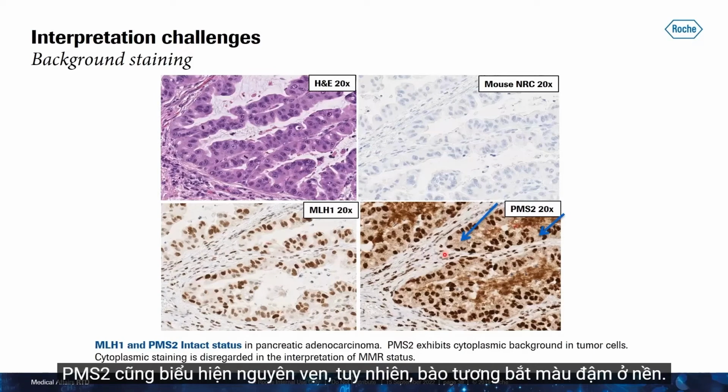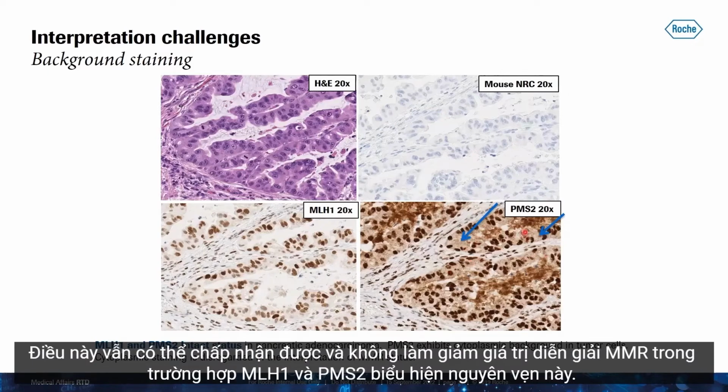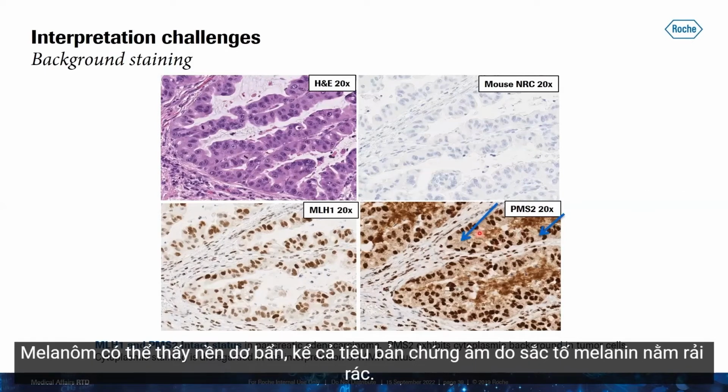PMS2 is also showing intact status, except that there is very dark cytoplasmic background staining, which is still acceptable and does not detract from the MMR interpretation, in this case of intact MLH1 and PMS2.